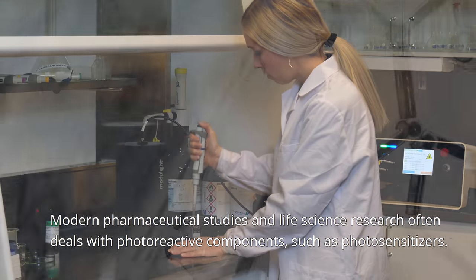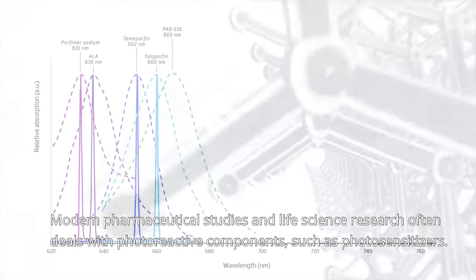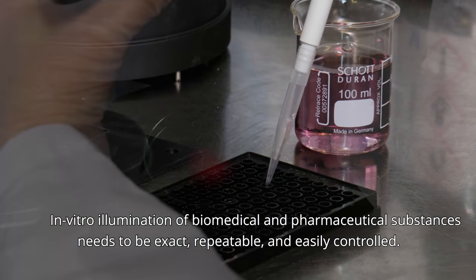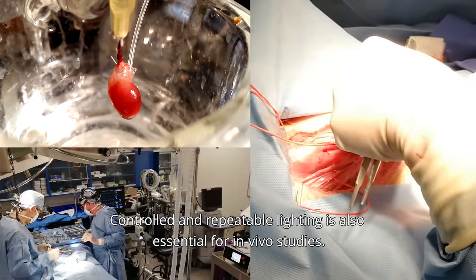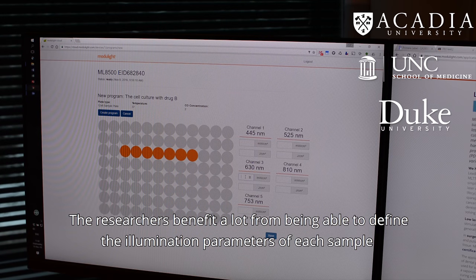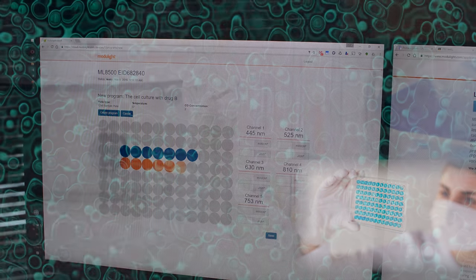Modern pharmaceutical studies and life science research often deal with photoreactive components such as photosensitizers. In vitro illumination of biomedical and pharmaceutical substances needs to be exact, repeatable, and easily controlled. Controlled and repeatable lighting is also essential for in vivo studies. Researchers benefit a lot from being able to define the illumination parameters of each sample accurately and smoothly each and every time.